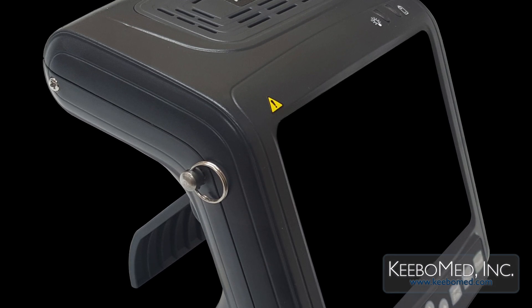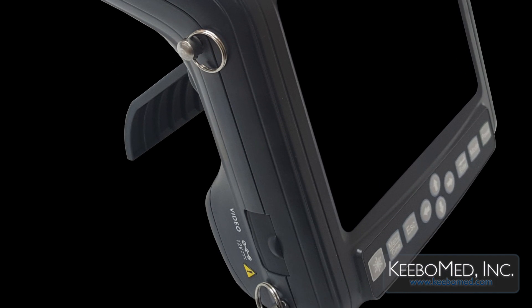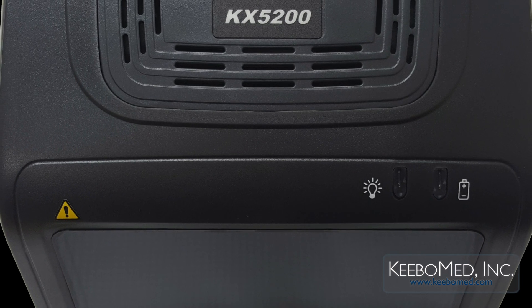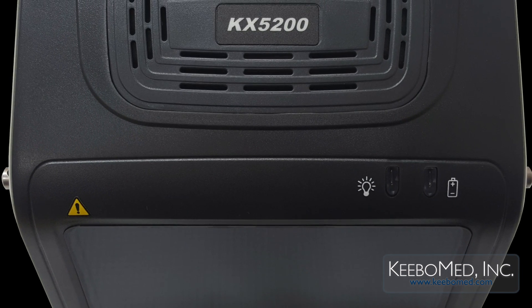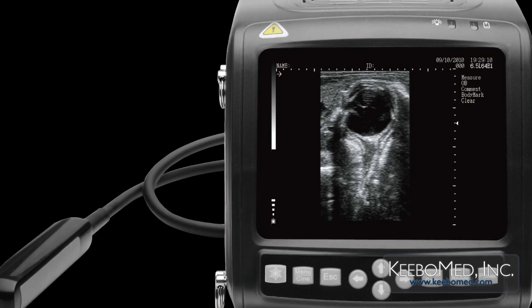The KX5200V is a fully digital veterinary ultrasound scanner and includes some of the best features and functions needed for veterinary examinations. As a handheld wrist ultrasound, it is very portable and produces high-quality images.